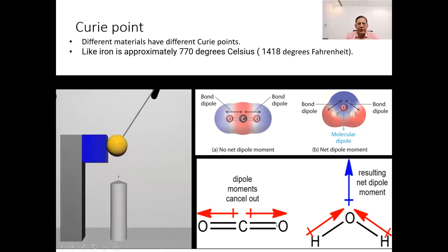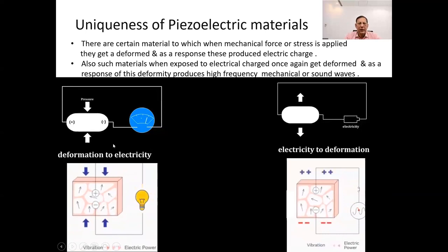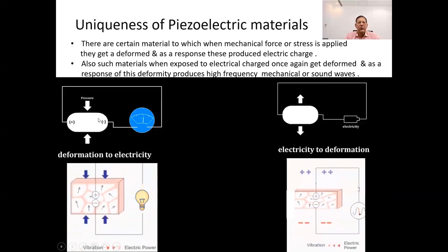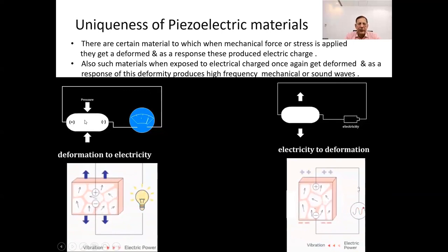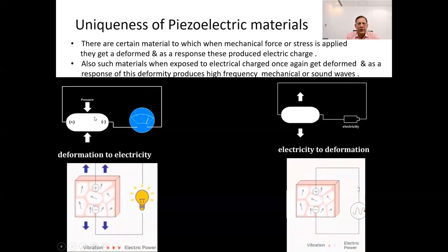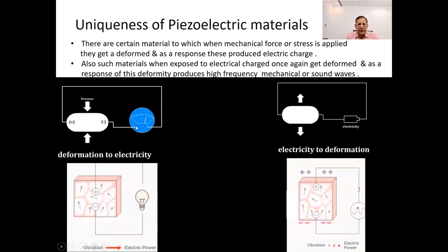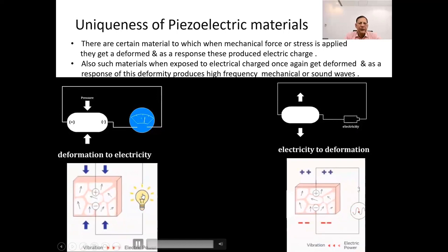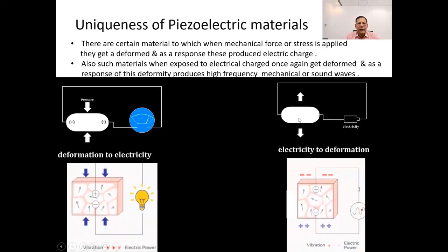Piezoelectric materials are fascinating substances that respond differently to mechanical stress and electrical fields. When a mechanical force or stress is applied to these materials, they bend or deform, and in response, they generate an electric charge. And when these materials are subjected to an electrical charge, they once again respond, but in a different way.